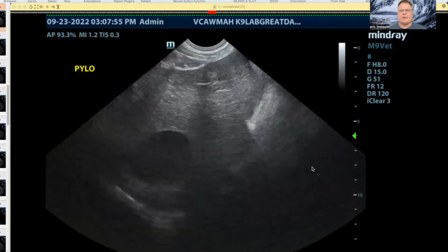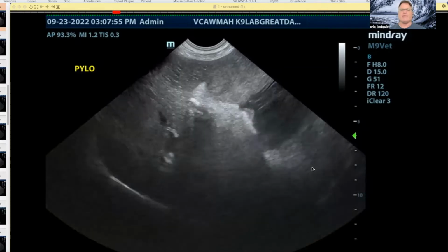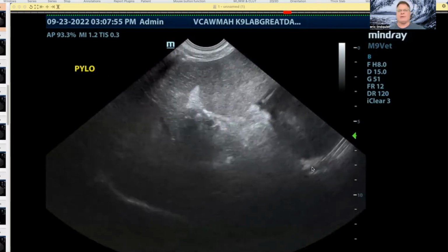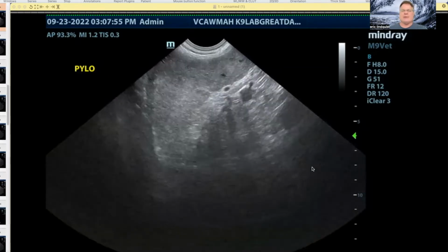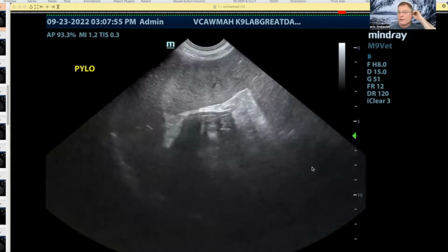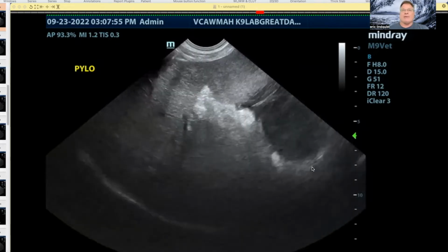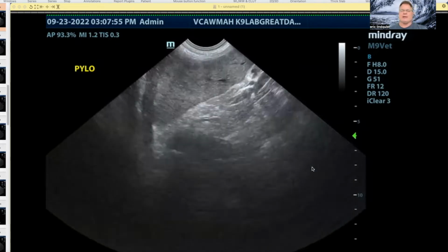We're back with Sono-Minutes, and we're going to address a very common scenario that we see from a clinical sonography standpoint. You have a mass in the abdomen, whether you see it on radiographs or palpate it clinically, and then you put a probe on it, and you want to know: is this a splenic mass, or a liver mass, or is it coming off of something else, adrenal, pancreas, anything else in that region?